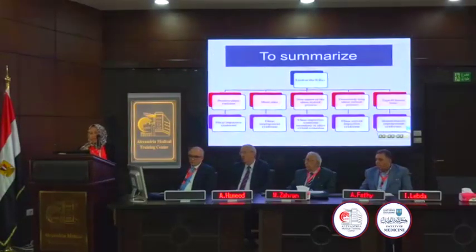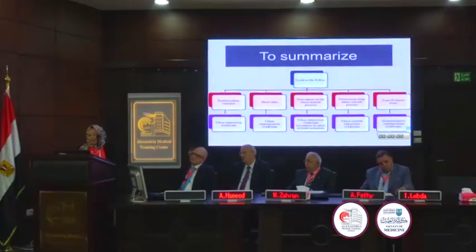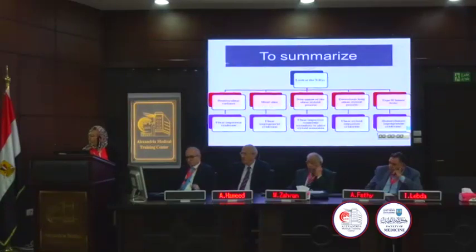So to summarize, at the ulnar side of the wrist, we have 5 types of impingement syndromes or impaction syndromes. To differentiate between them, we look at the X-ray. If I have positive ulnar variance in the acute clinical context, of course, we can think about the ulnar impaction syndrome, and we will proceed by MRI to identify the rest of the spectrum of this pathological condition. If we have short ulna, we can think about the ulnar impingement syndrome.